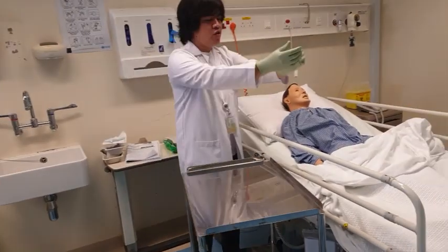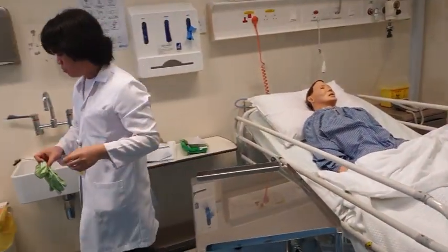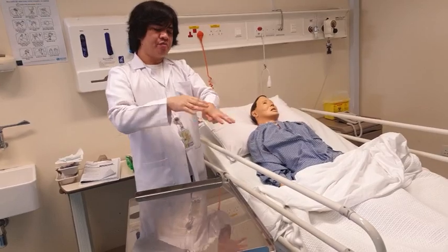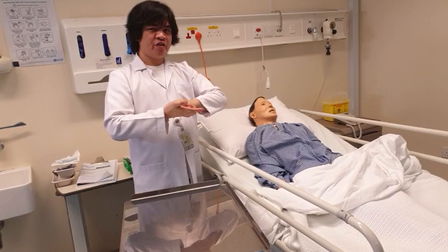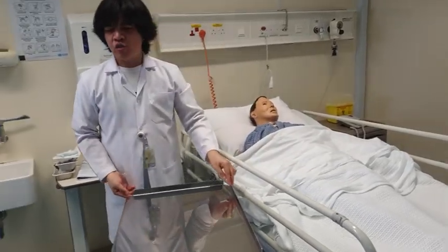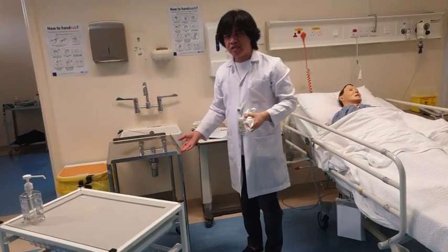And of course, you never leave your patient unattended. Okay? Remove your gloves. And make sure that your patient is well covered. And make sure that your patient is placed comfortably on bed. So we're done, sir, with the dressing. How are you? So we'll return back all the materials that we have used. Again, we disinfect this table with the wipes if necessary.